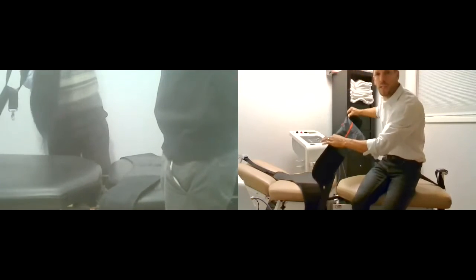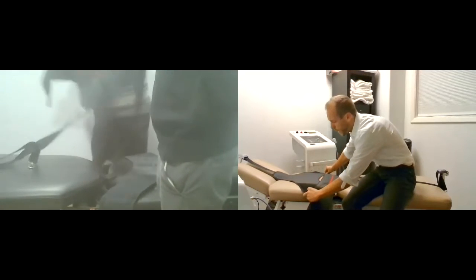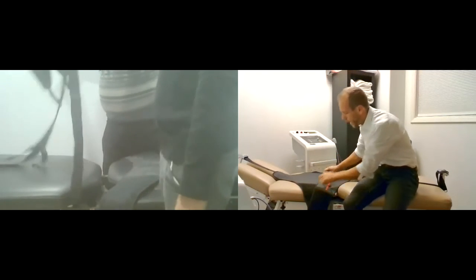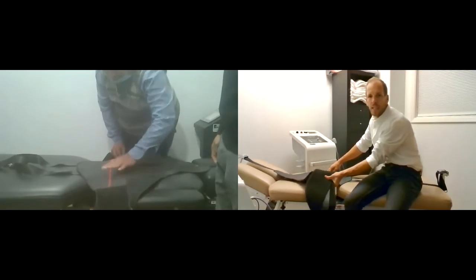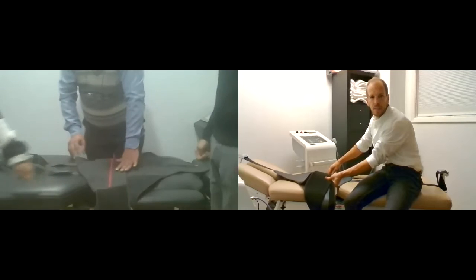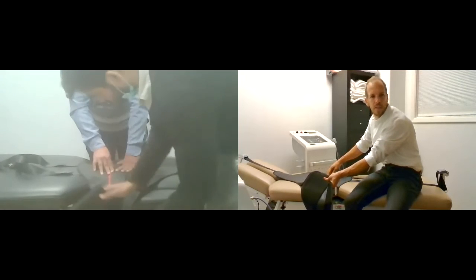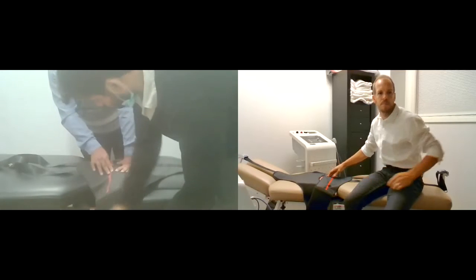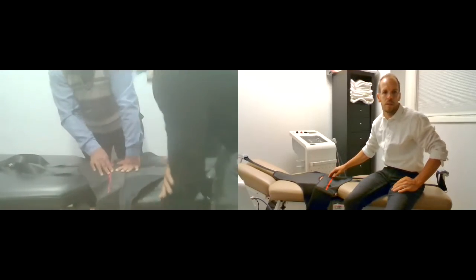Then what you're going to do is set it down one time. Again, you're going to set it down with your red line right at the bottom of that cushion, and then Velcro this side so that it stays. Then the other side, closest to the doctor, on the other side. Perfect.